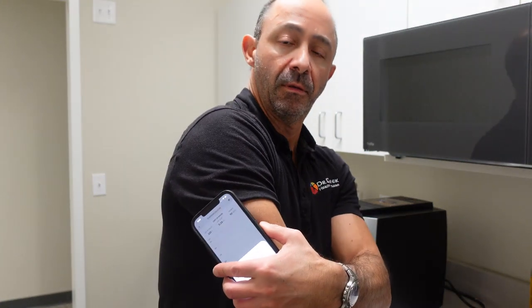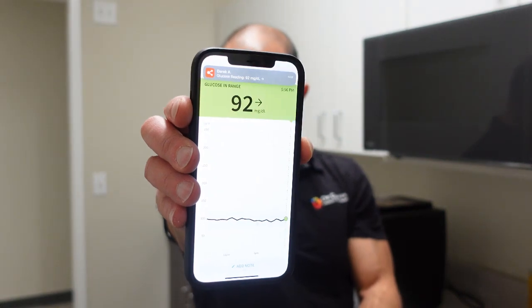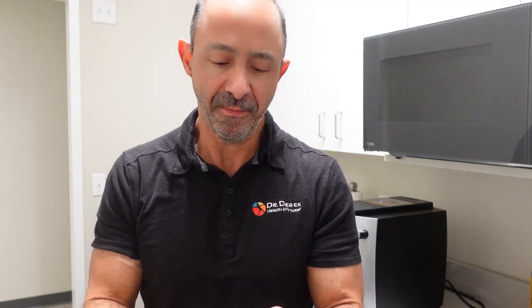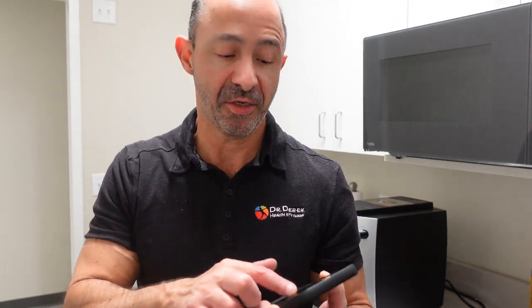Let's keep watching. Okay, so now it's been over 45 minutes since I had the Greek yogurt. Let's take a look at the glucose now. And 92, which is pretty much back where I started from. In fact, I believe it was 91 when I first started. And in fact, when I started even before I had anything at 91, went up to a high of 93, been around 85, 88, 92. So pretty darn consistent throughout the entire test.